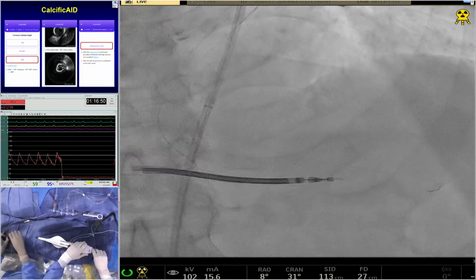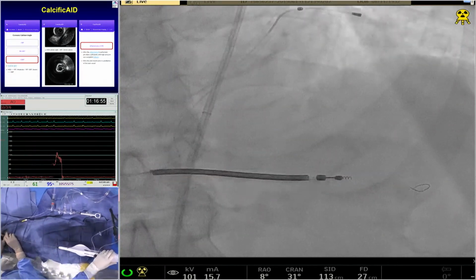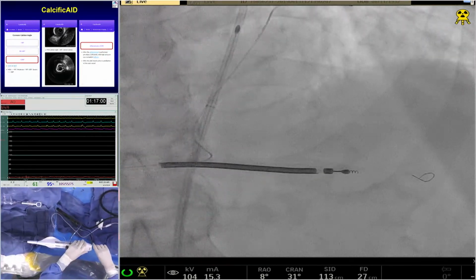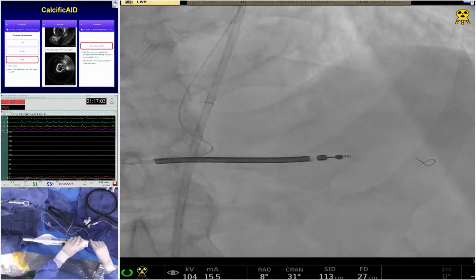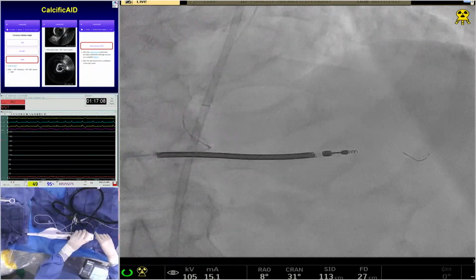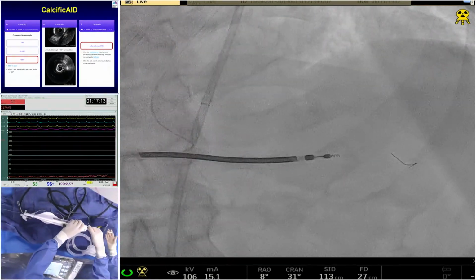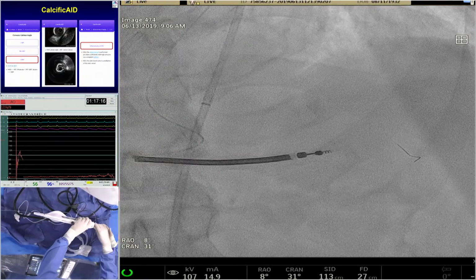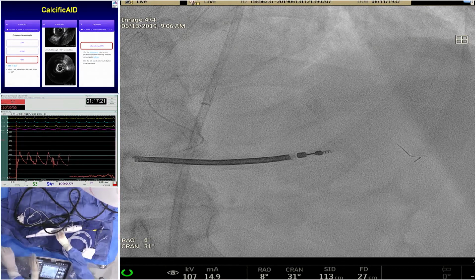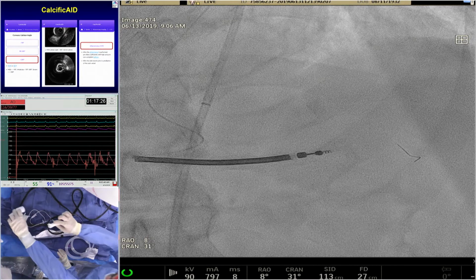Blood pressure is good. For those of you who might have been worried about hemodynamic support in this 86-year-old man, I think it's important to think about that. Of course, you always want to have seat belts on. I bet she has a sheath on the other side. Yes. Access is ready to go if needed. And I think, look, it's difficult to know who may or may not need it. I probably would have been a little bit nervous about not having Impella support here with rotational atherectomy in an 86-year-old, but I'm not Dr. Kinney. She's much more qualified for these very, very difficult cases.